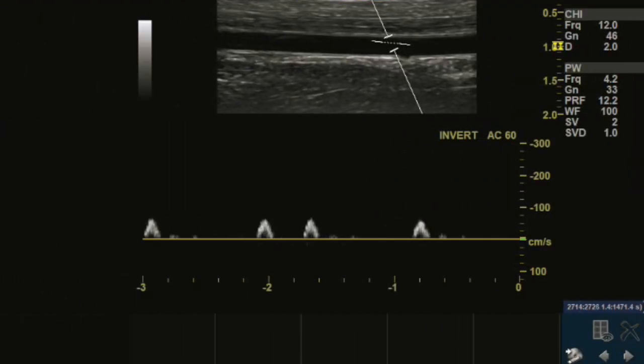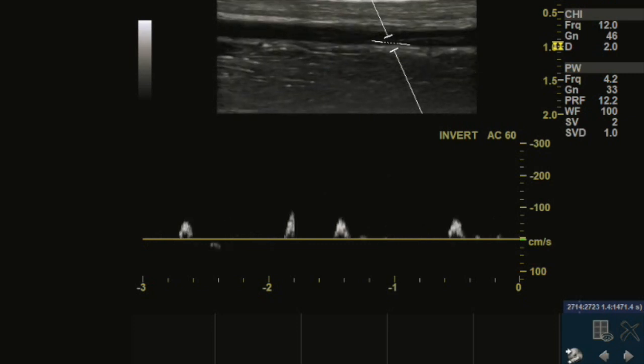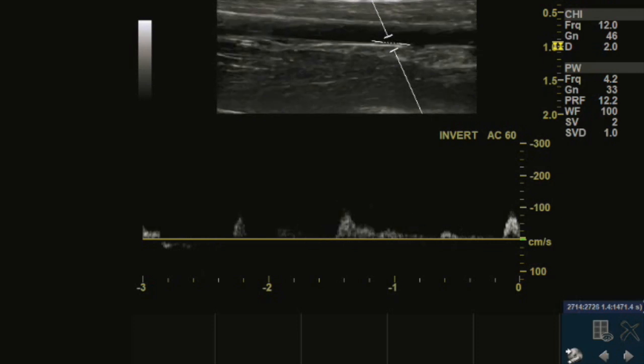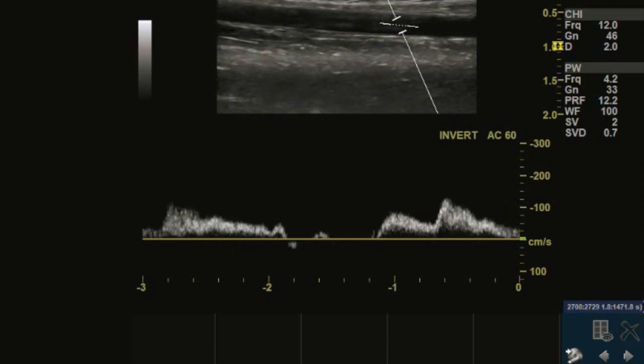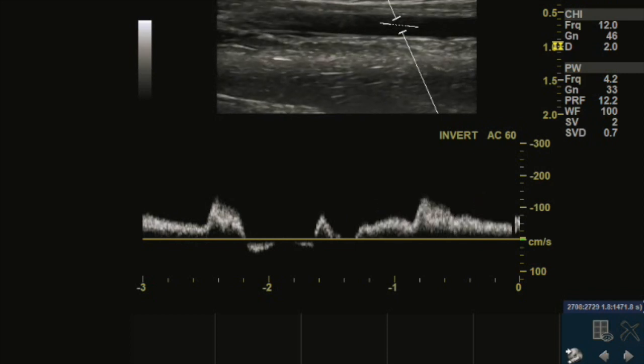Now for an example, we can see here in a resting condition, the ultrasound is able to capture intermittent increases in blood flow velocity from our pulse. Then, in an exercising condition, we can see a considerable increase in blood flow velocity in the same artery from the increase in blood perfusion to the working muscle.